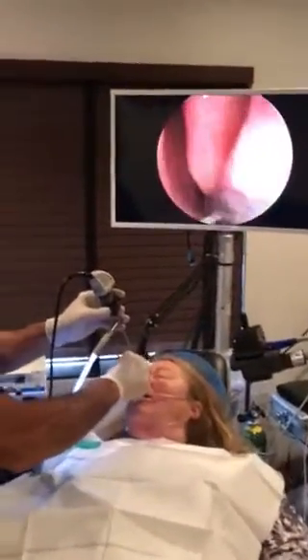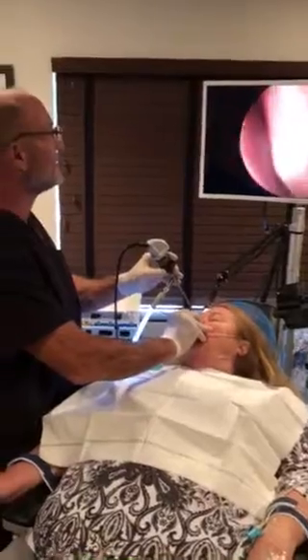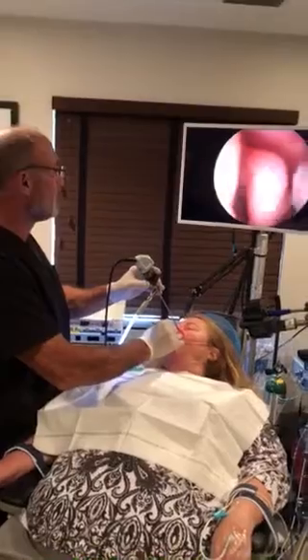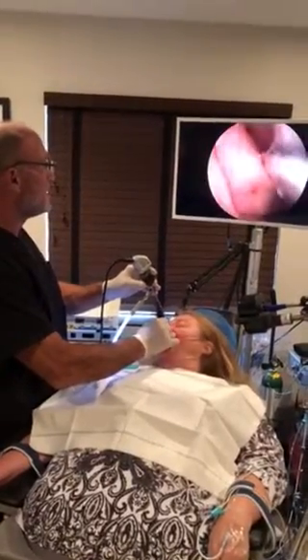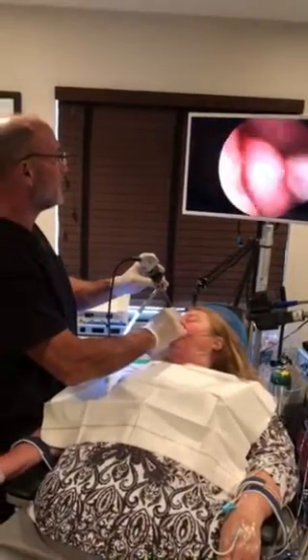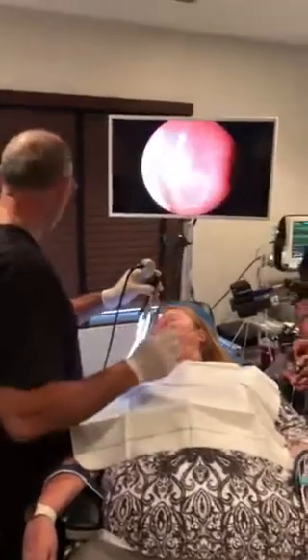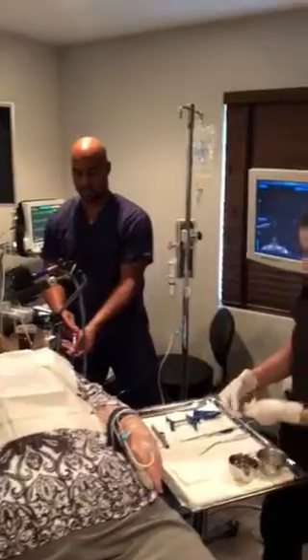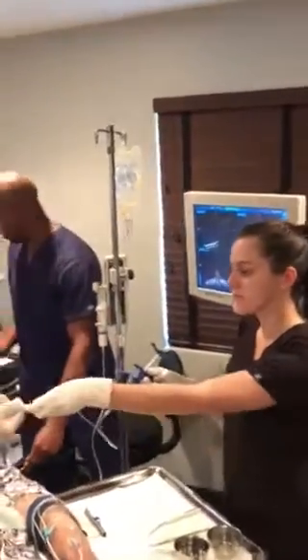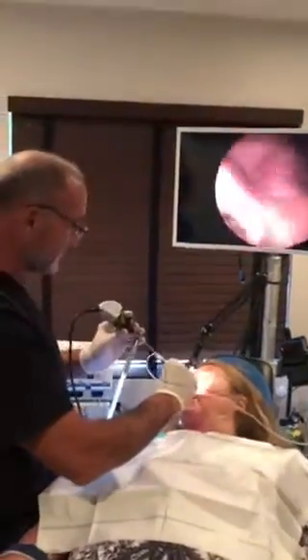Nicole and Michelle are assisting me today. We're just making some adjustments in the anatomy here to make our patient breathe a little better. Over here we have traced out our CAT scan of the patient, and it correlates with our instruments. That is perfect — it correlates with our visualization.